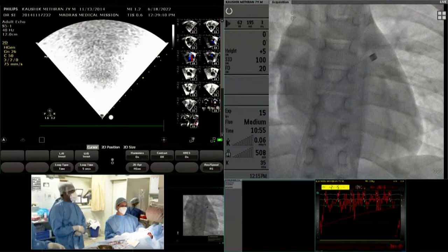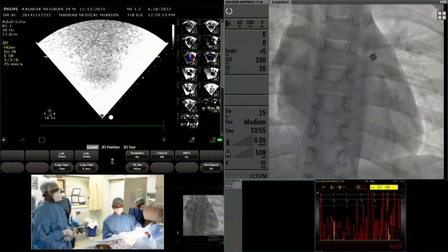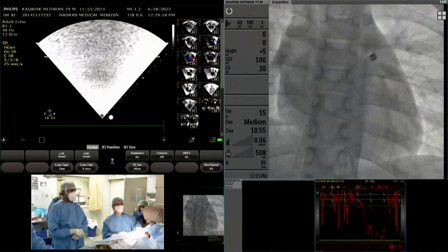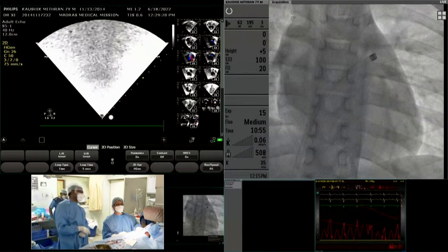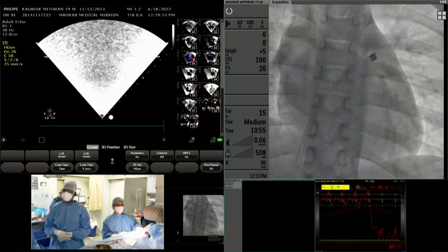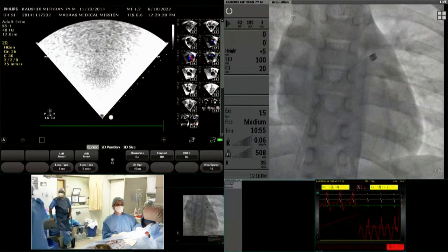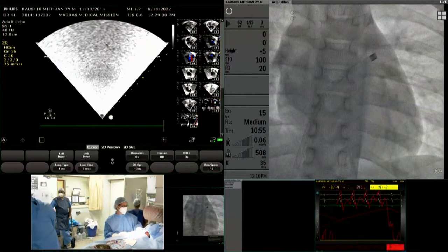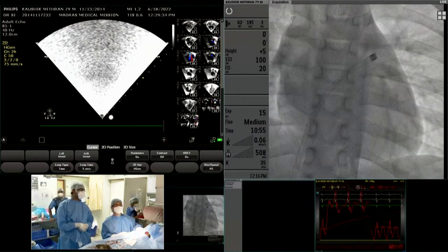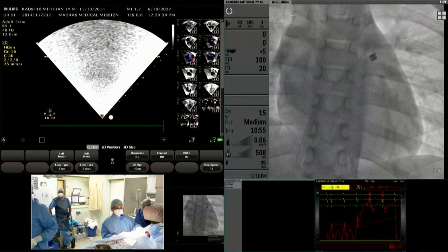Prabhu, get me a LifeTech 12 millimeter device and a 14 millimeter device. Let me decide. What is the LA disc size? It is 26, right? This is a 14. Your balloon is 12, and I don't see any constriction. So I'm actually worried about the 12 device.